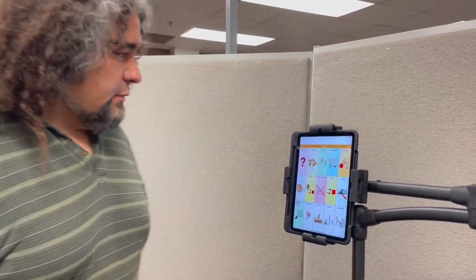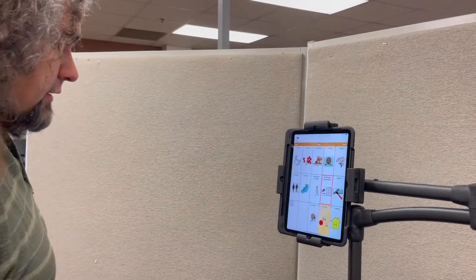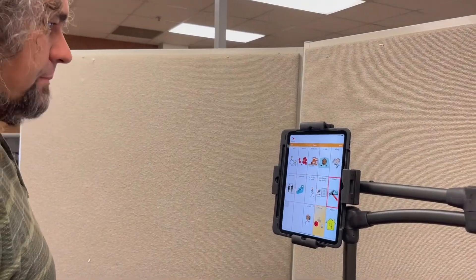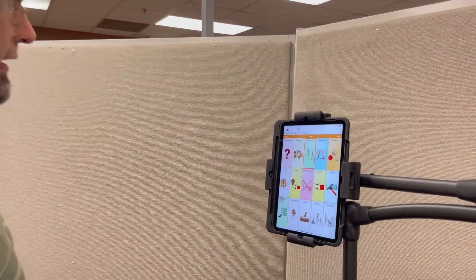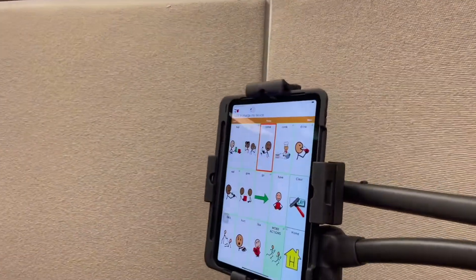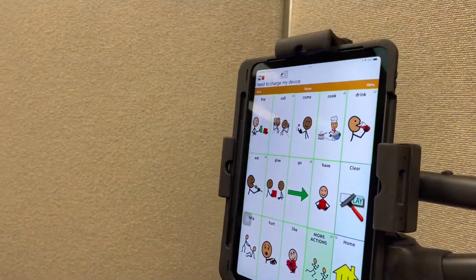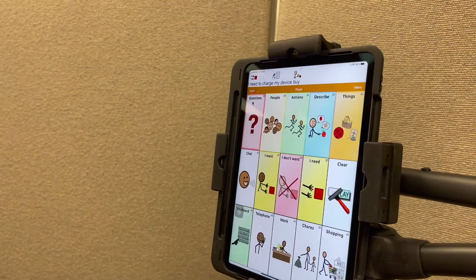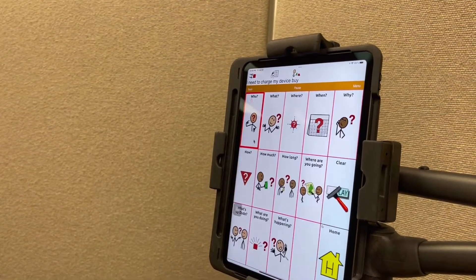And again this isn't eye gaze, this is head tracking. So if someone doesn't have good head movement it's not a good option. You can see when I move in front, I can move my head up and down and back and forth, and activate by raising my eyebrows.